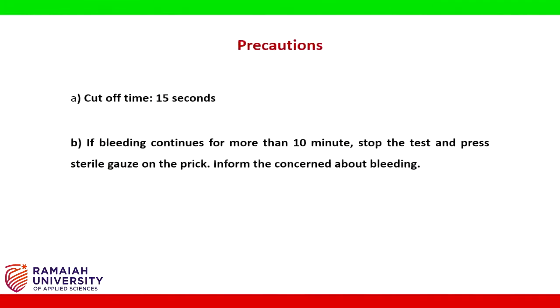Precautions: cutoff time 15 seconds. If bleeding continues for more than 10 minutes, stop the test and press the sterile gauze on the prick. Inform the concerned person about bleeding.